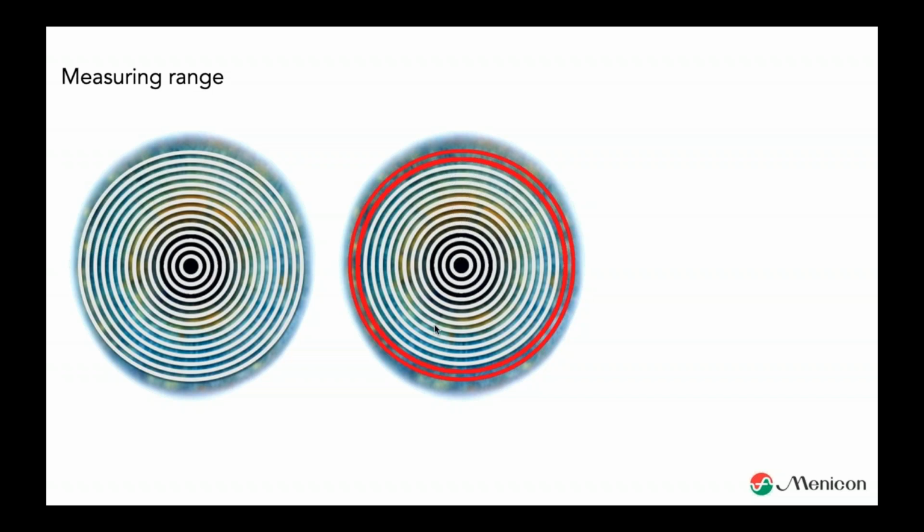Most of the topographers with a bit smaller measuring range are the topographers with a bigger cone, so your head almost disappears in the cone. Another thing to mention is that if you don't move the head position correctly, you miss even more, and then it becomes difficult because we have to extrapolate more and more.